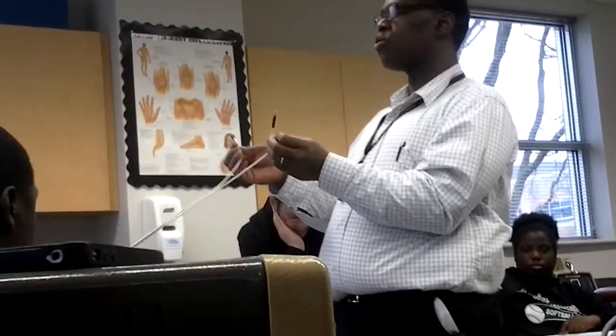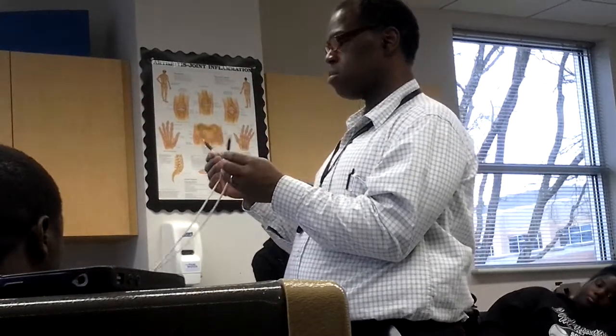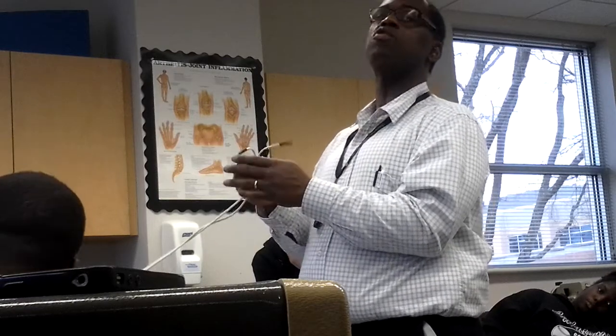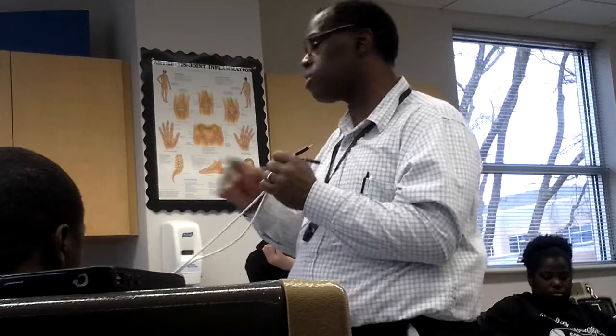Reciprocate. What is going to happen? I have a pad here, I have a pad here. They're equal size. I turn this machine on reciprocate. What is it that the person is getting? Intermittent energy. So it comes on this one, it's trying to go to that one, but that one is not on the body. So it just bounces back and forth.